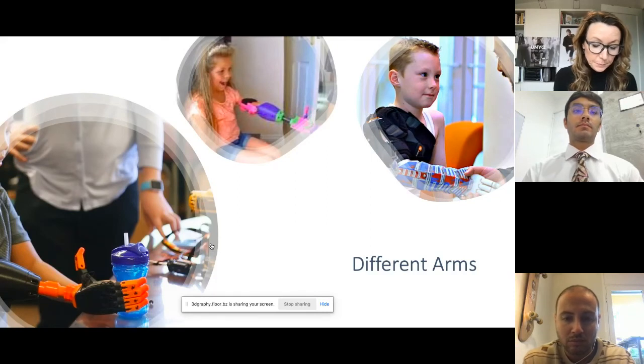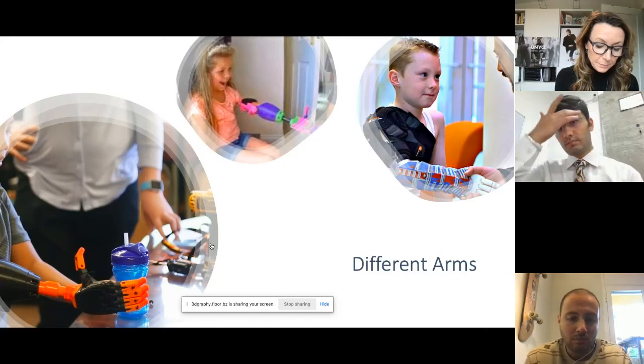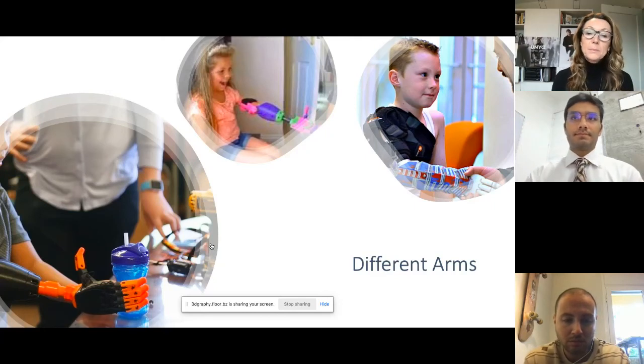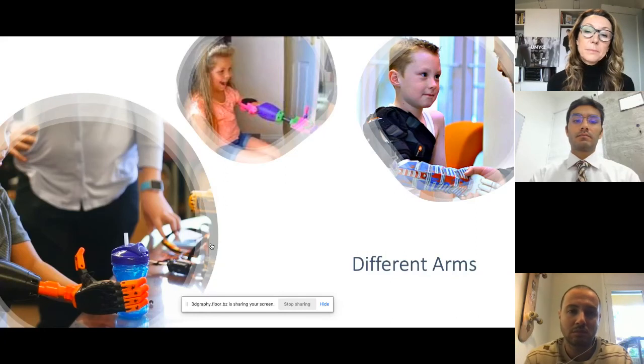Especially this arm started creating a miracle for kids, where you can see the joy on the face of the kids when they can hold a bottle, they can drink with their own hands. And most important, these arms were free for them. They can print it. And the major place where 3D printing made a huge difference was that as a child grows, his arm size grows and the arm needs to be replaced every second year. So that becomes difficult for a father or a mother, because it would be a really expensive matter. So 3D printing played a huge role where you don't need to spend much. You can actually print your file and make your arm.